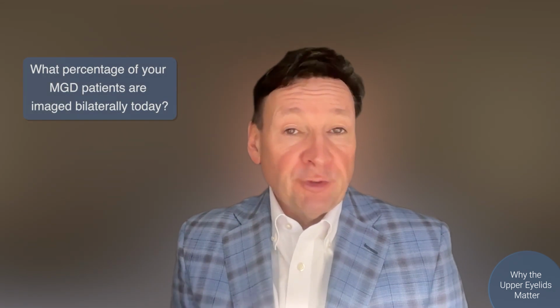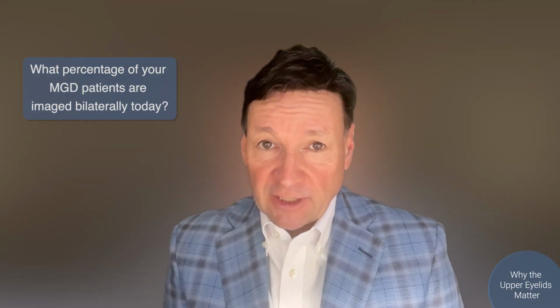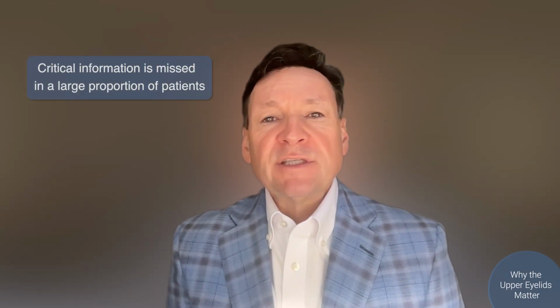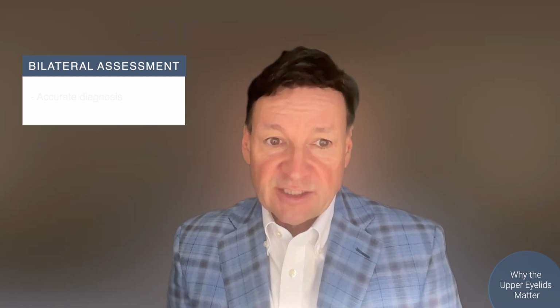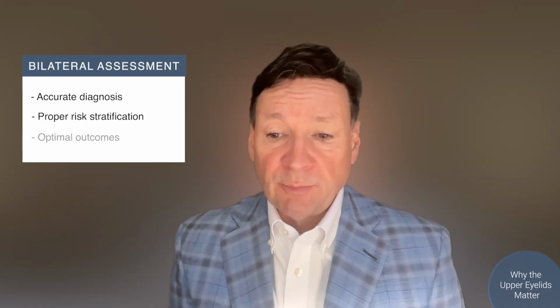Before we dive into each one, I want you to consider a simple question. What percentage of your meibomian gland dysfunction patients are you imaging bilaterally, upper and lower eyelids, today? In most practices I visit, that number is less than 50%. That means we are potentially missing critical diagnostic information in a large proportion of patients. The evidence I'll share with you today shows that bilateral assessment is not a nice-to-have. It is essential for accurate diagnosis, proper risk stratification, and optimal outcomes.